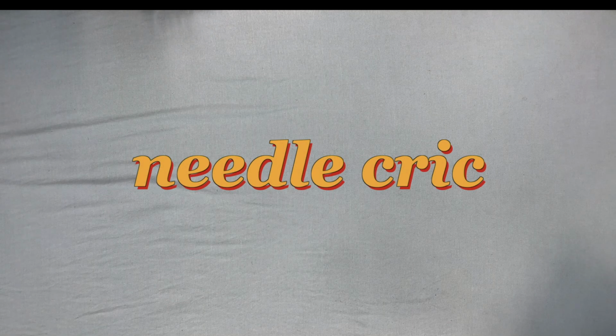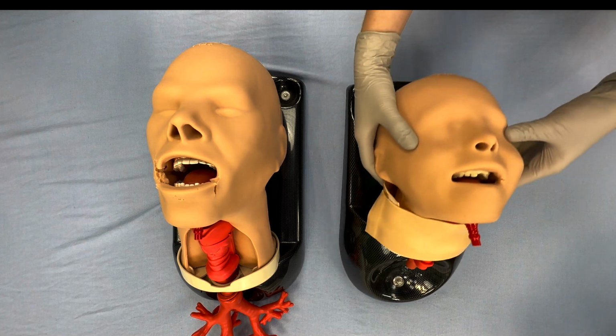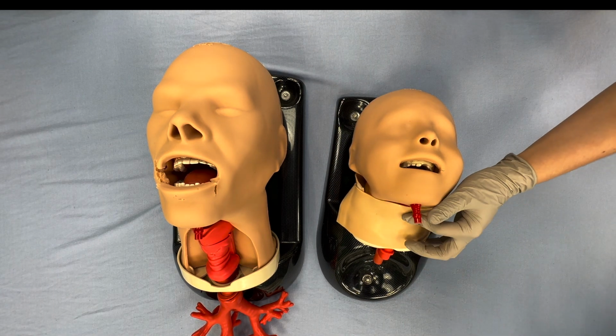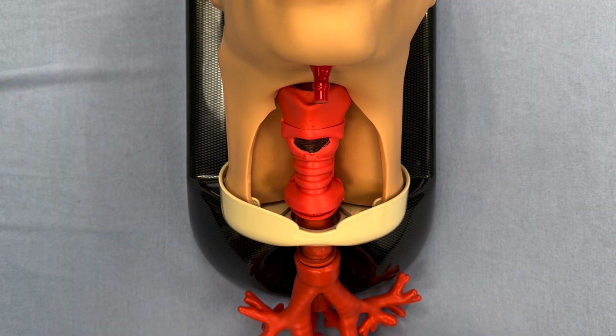In a situation where you can't intubate or ventilate a patient, you need to perform a cricothyrotomy. But if we're talking about a pediatric patient, the equipment used for a cricothyrotomy is going to be different due to the accessibility of the cricothyroid membrane. Okay, so here's an adult's trachea.